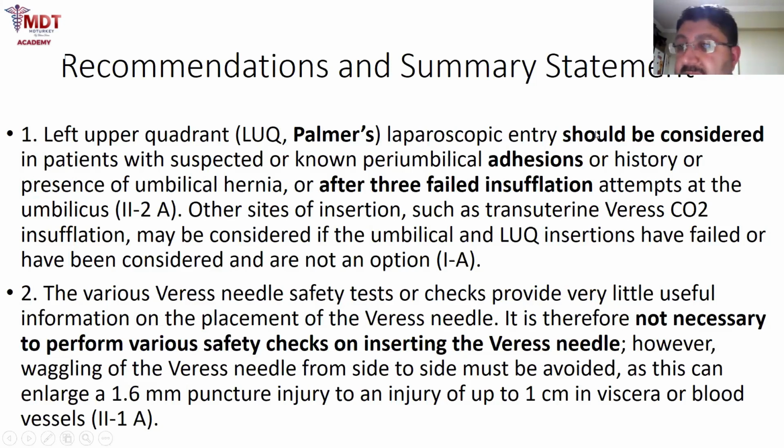They recommend that if the patient has any adhesion or risk of adhesion, or history of umbilical hernia or abdominal wall hernia, they advise to use Palmer's point.